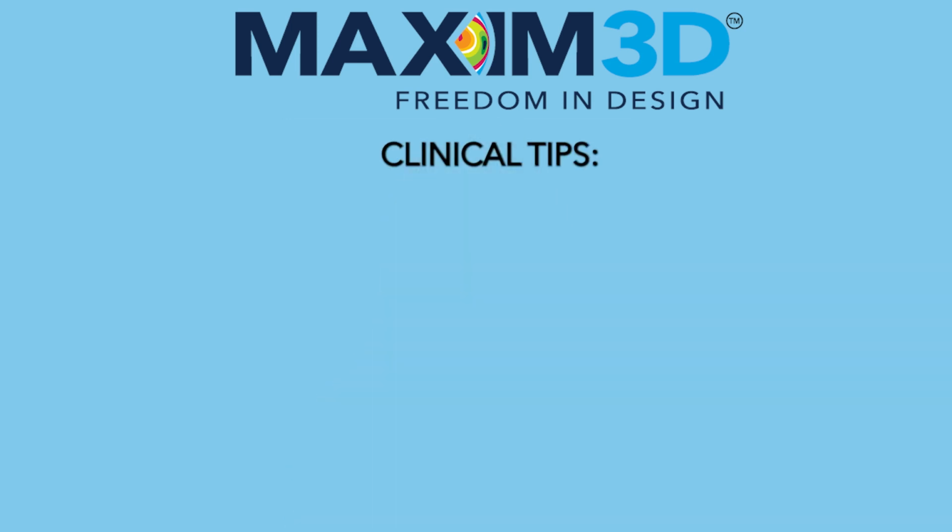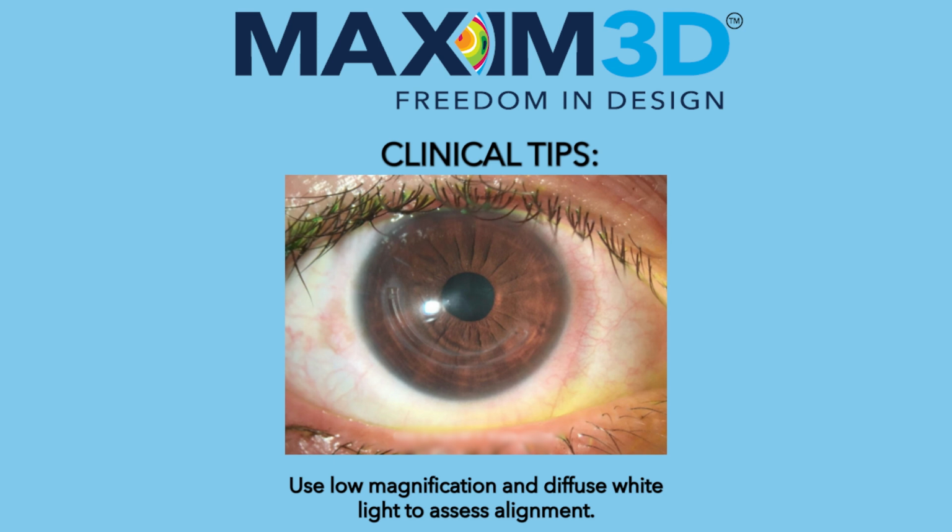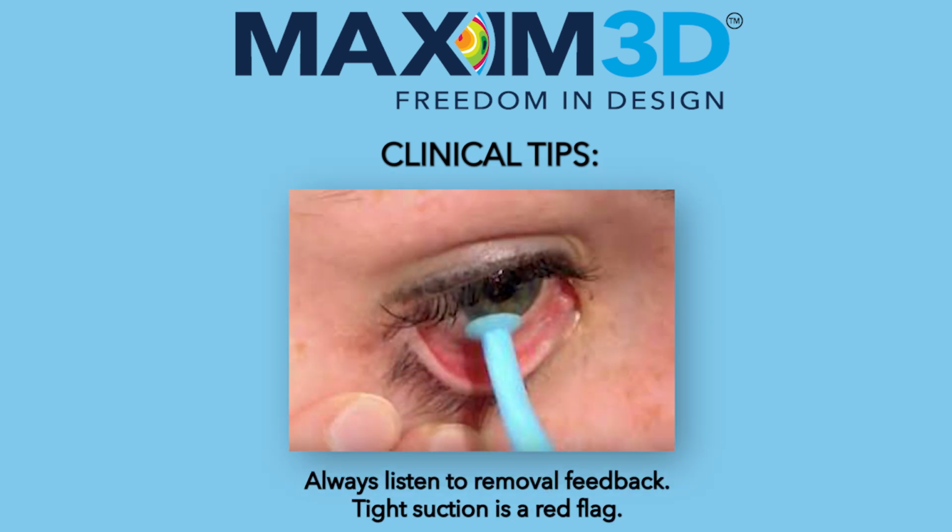Our suggested clinical tips: evaluate 360 degrees, especially 3 and 9 o'clock. Use low magnification and diffuse white light to assess alignment. Always listen to removal feedback. Tight suction is a red flag.